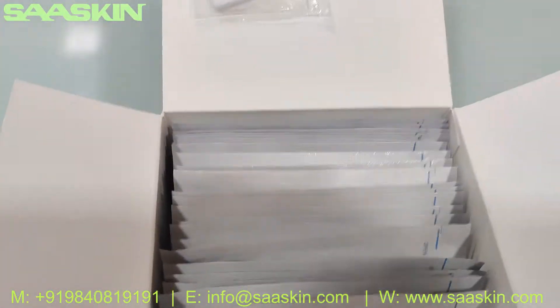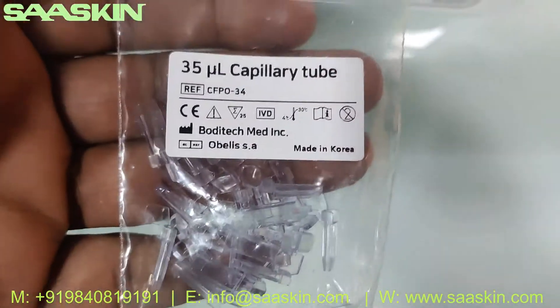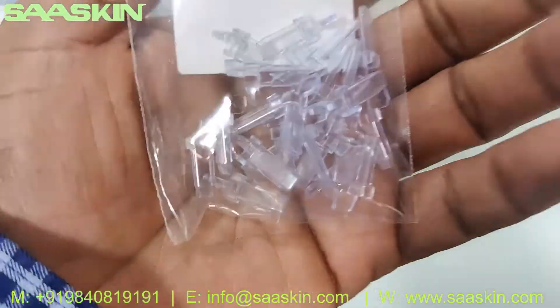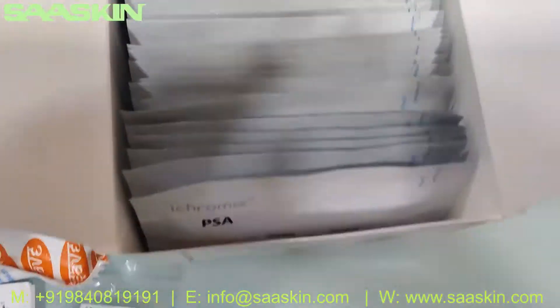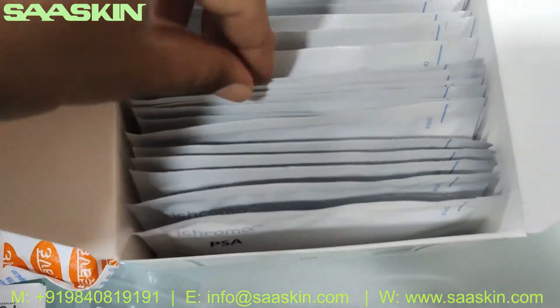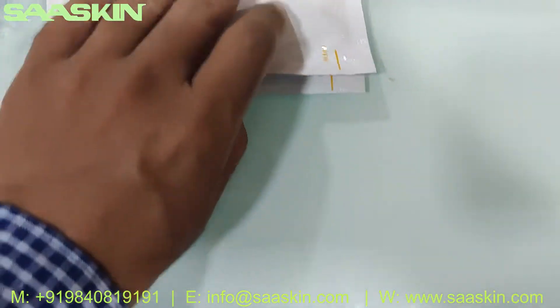Inside you can see there are 25 pieces of capillary tubes — these are 35 microliter capillary tubes, 25 in number. This is a 25-test kit pack, so you get 25 capillary tubes. And inside the box you have 25 test cartridges. Let me take two cartridges out to show you — this is how the cartridges look.